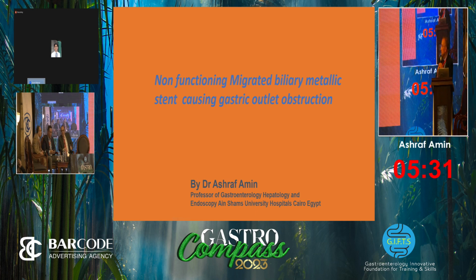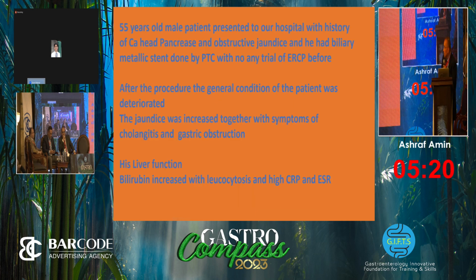Okay, we are going to present one video case, an ERCP case, which is a non-functioning migrated biliary metallic stent causing gastric outlet obstruction. This 55-year-old male patient presented to our hospital with a history of CA pancreas and obstructive jaundice, and he had a biliary metallic stent done by PTC with no trial of ERCP.